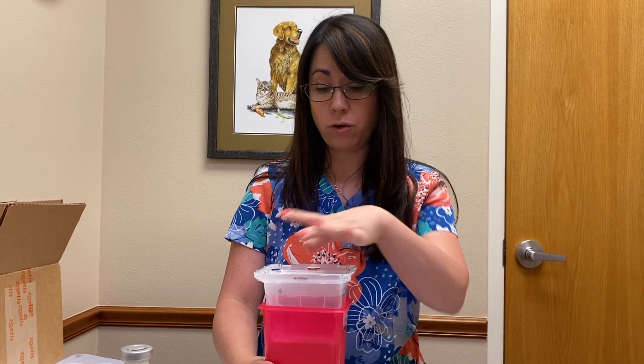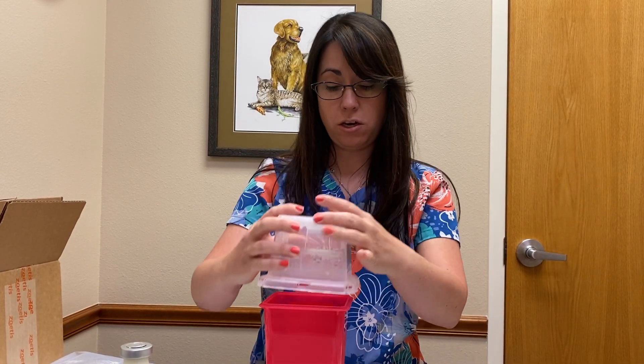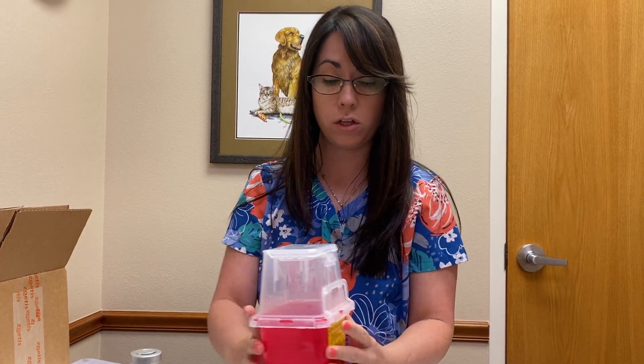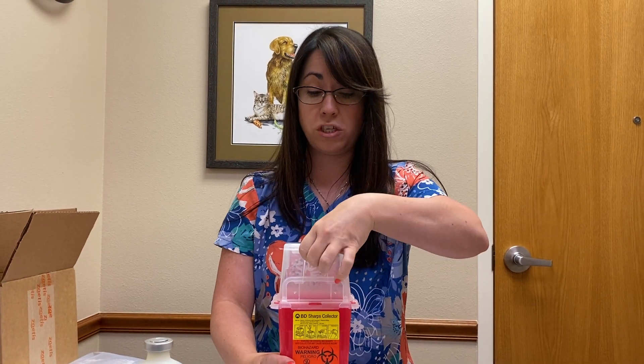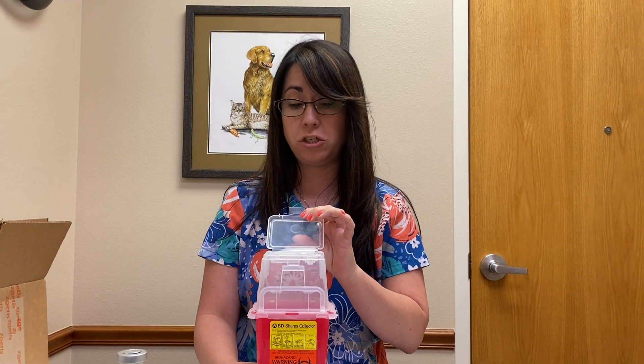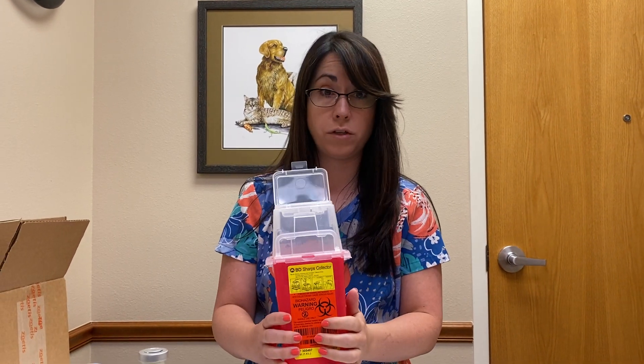You're also going to have a sharps container so that you can appropriately dispose of those needles. When you get the sharps container, go ahead and push the top down until you feel it all click. When you dispose of the needle, make sure you just dispose of the needle and not the entire syringe, as you'll be giving multiple injections and this container will not hold all of the syringes.